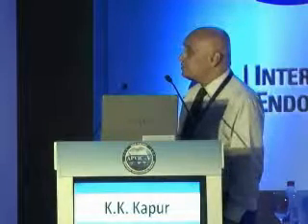Now this is an example of a compression being applied normally, the long axis and the short axis both being seen. The veins are getting compressed, which means that there is no DVT. This red one is the venous system, and when you compress, it gets obliterated. Now this is a case of a DVT, and in this DVT you can see that the femoral vein on probe compression is not getting compressed, and of course there is no spontaneous flow.